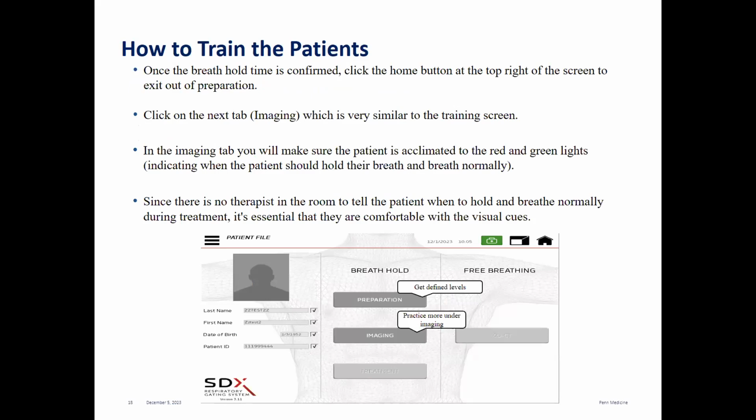And then, once you save that, you're going to be brought back to the main screen and you're going to click on the imaging tab. The imaging tab is where you're going to practice with the SDX with them and get them super comfortable with it. It is very similar to the preparation stage. There really is no difference.